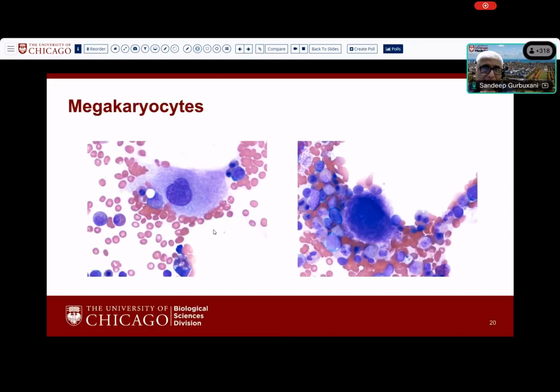Finally, we saw the megakaryocyte from low magnification. Here you have a mature megakaryocyte. It is the largest cell in the bone marrow. It has this lobulated nucleus. The ploidy of these megakaryocytes is very high because they develop with this process of endoreplication, where the nuclear material keeps multiplying, but the cell doesn't divide into multiple cells. It just forms its nuclear membrane, and you can get a ploidy of as high as 64 and sometimes 128 N as well.